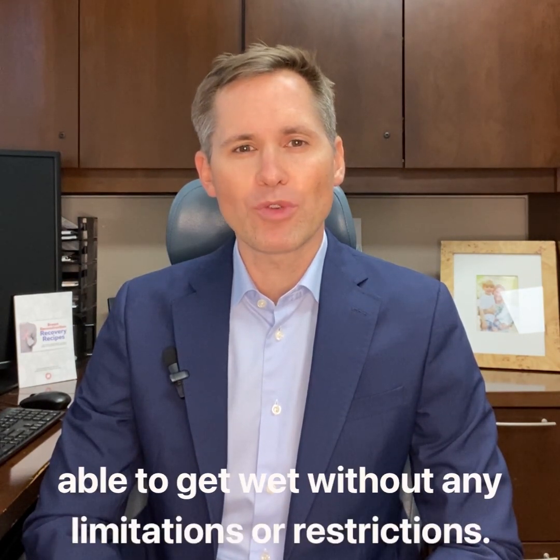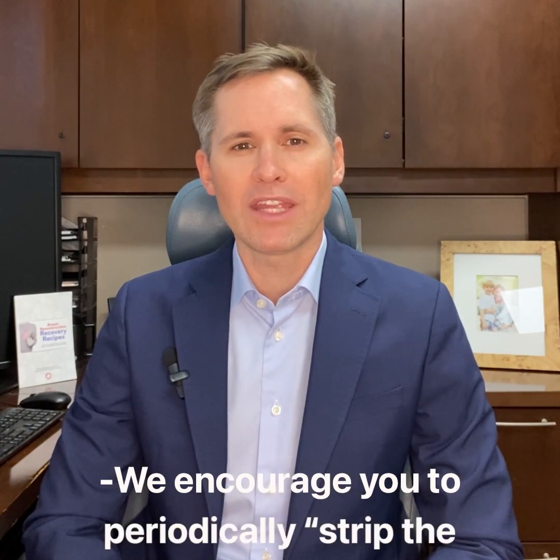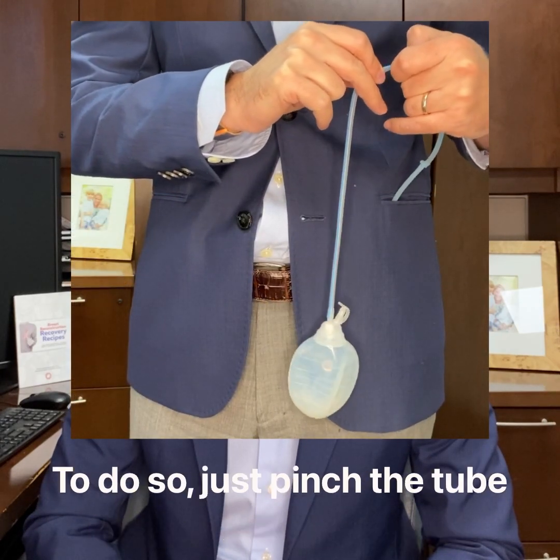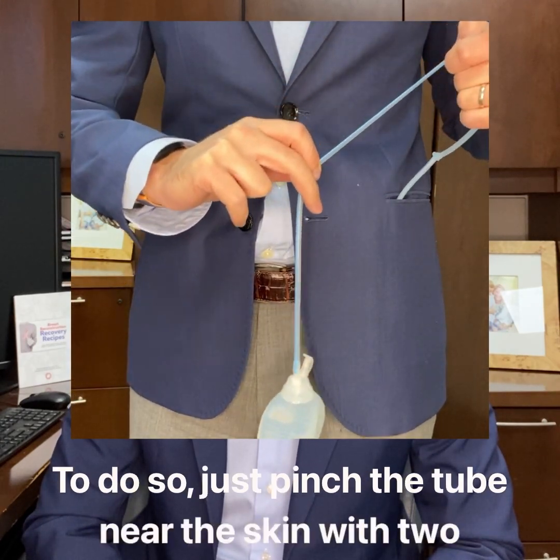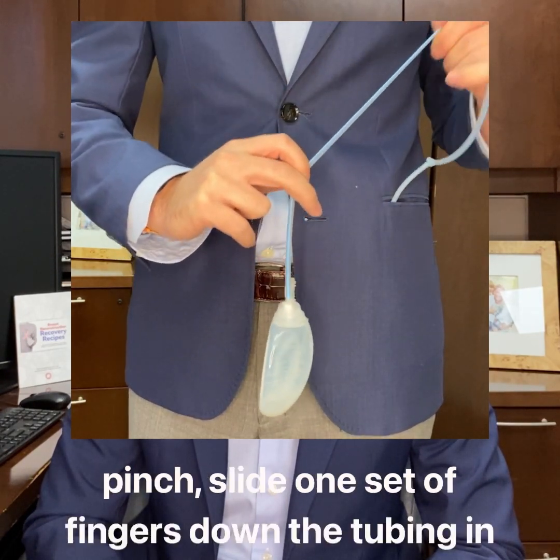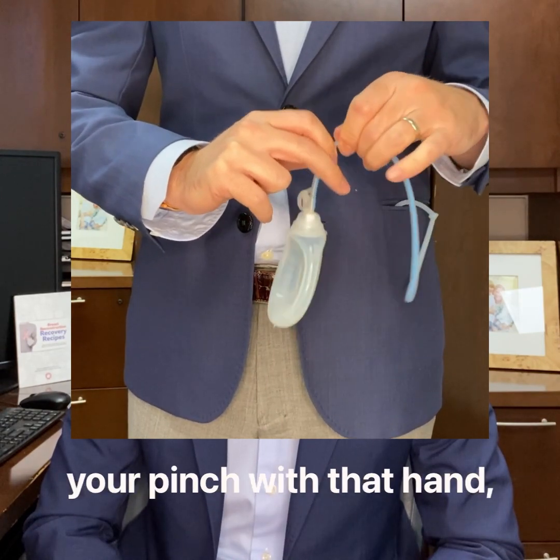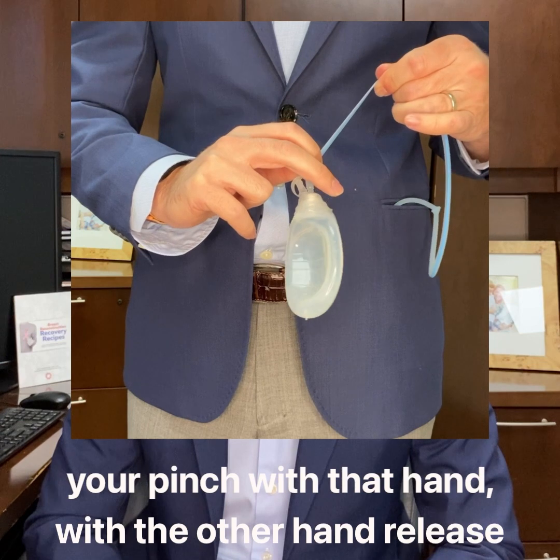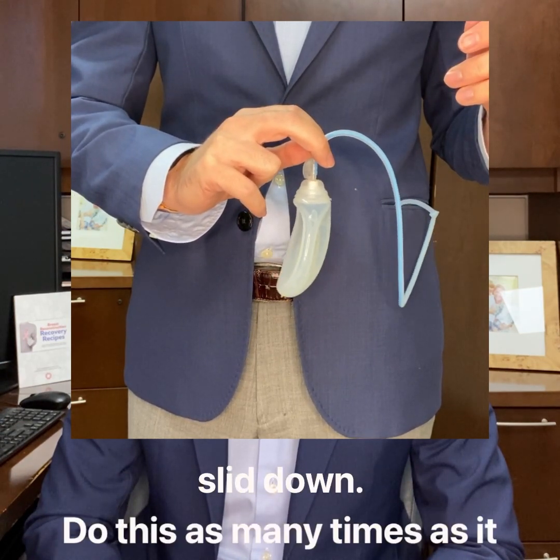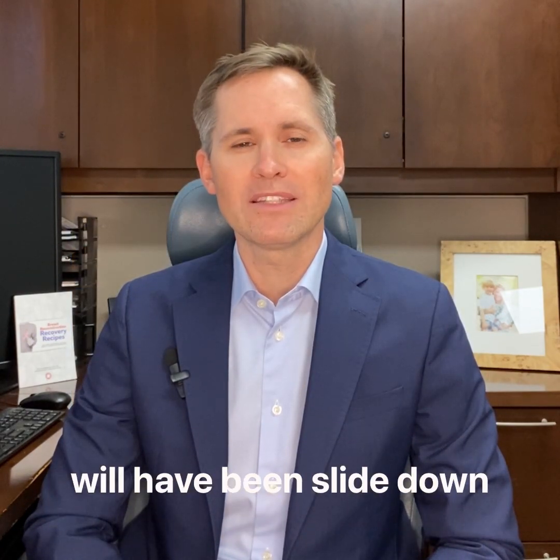We encourage you to periodically strip the drain. This will clear any debris from the tubing and move it into the collection bulb. To do so, just pinch the tube near the skin with two fingers on both hands. Then, while continuing to pinch, slide one set of fingers down the tubing in the direction of the bulb. Then, without releasing your pinch with that hand, with the other hand release the tube and re-pinch next to the fingers that have been slid down. Do this as many times as it takes to reach the bulb. If there had been any debris, it will have been slid down the tube into the collection bulb.